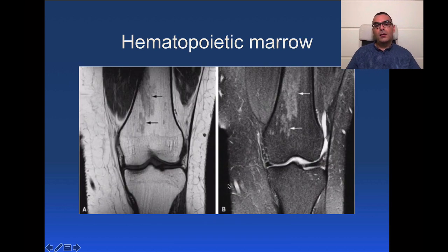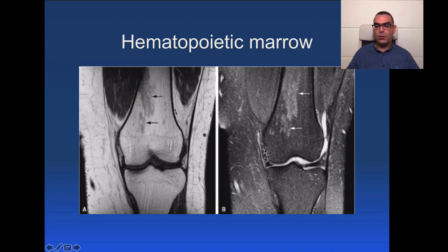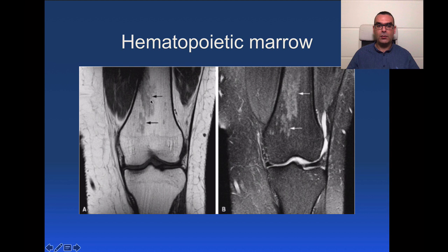One very common pitfall often referred to us by orthopedic surgeons with suspicion of tumor is just hematopoietic bone marrow. With red marrow reconversion, on fat suppression sequences you don't see the homogeneous hyperintense signal of fatty marrow; instead you see patchy hyperintense areas, and corresponding T1 shows patchy hypointense areas. This is commonly seen in females of menstruating age due to underlying mild anemia.